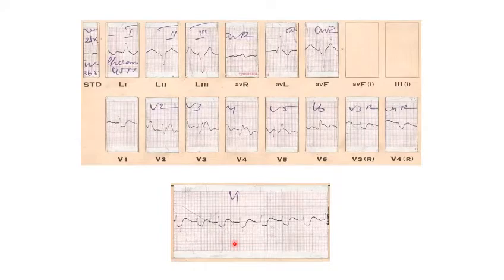You should say that the ECG is showing left bundle branch block, 2:1 block. What else? Sir, this is LVH, because left axis is there. That is 100%. If the examiner asks you, you can discuss the presence of a left axis deviation in a patient with left bundle branch block. You can indicate LVH. Yes, that can be discussed.